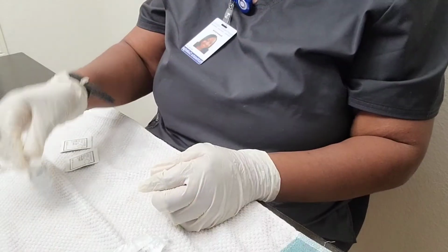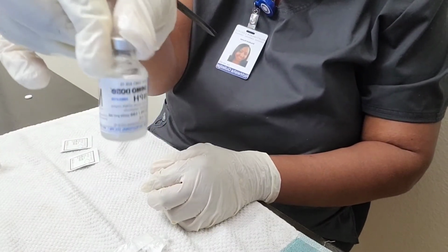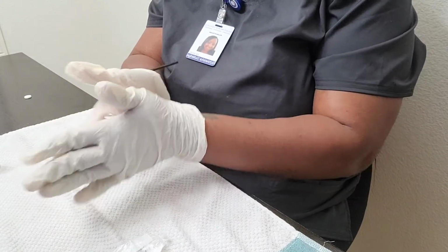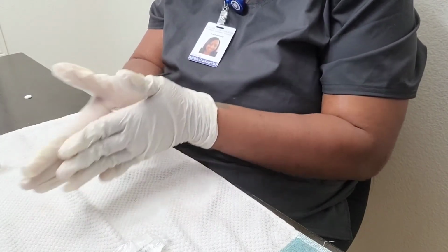For this video, it will be 12 units total of insulin medication. Okay, I'm going to take the cloudy NPH and roll it between my palms. I'm not going to shake it. I'm just going to roll it so it can mix well.